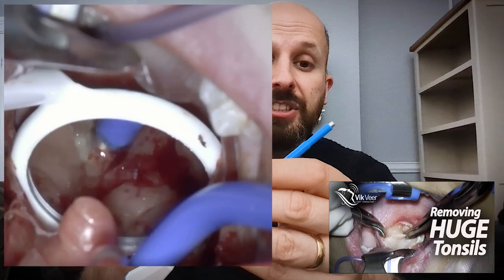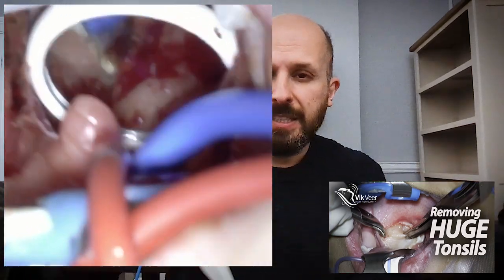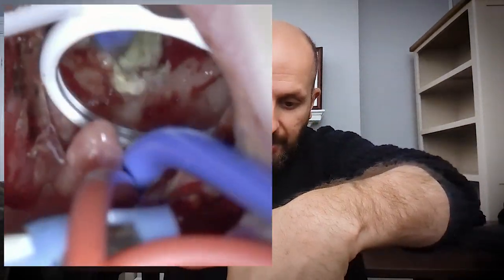At the end here you'll see there's a little electrode. If you look at my last video where I tried really hard to show an adenoidectomy, you'll see I have to do this upside down — you're looking in your mouth, behind the palate, the dangling thing at the back of your throat — looking behind there and operating upside down with the help of a mirror.